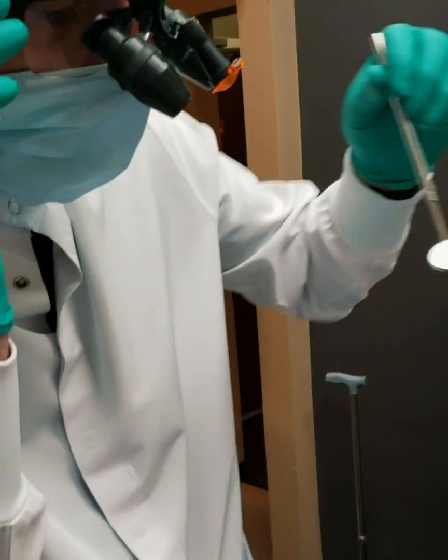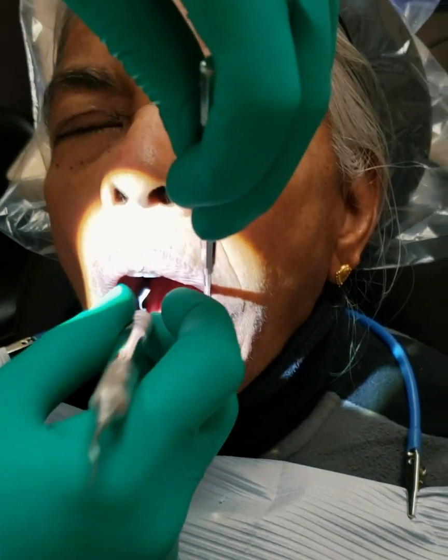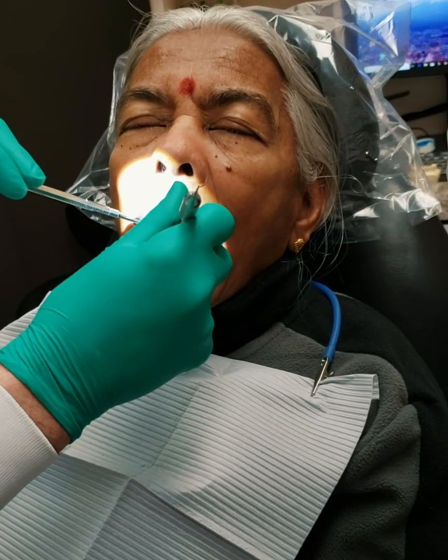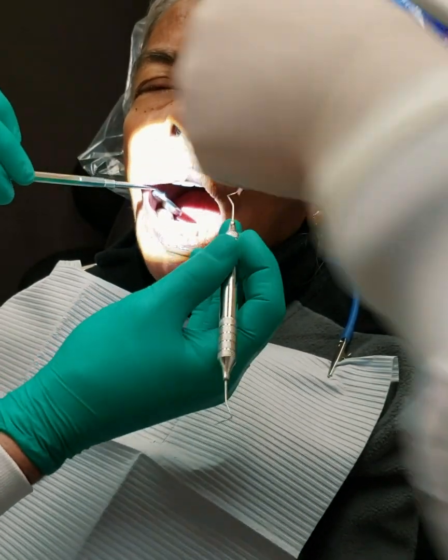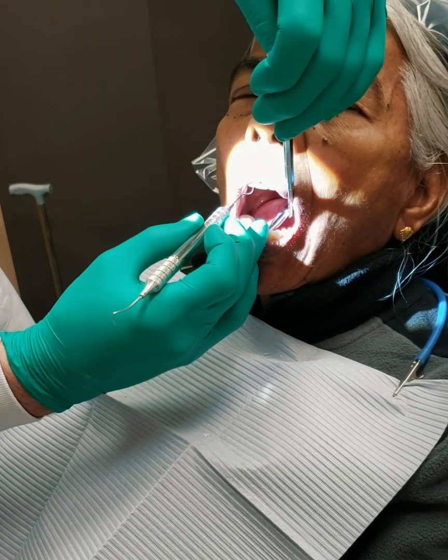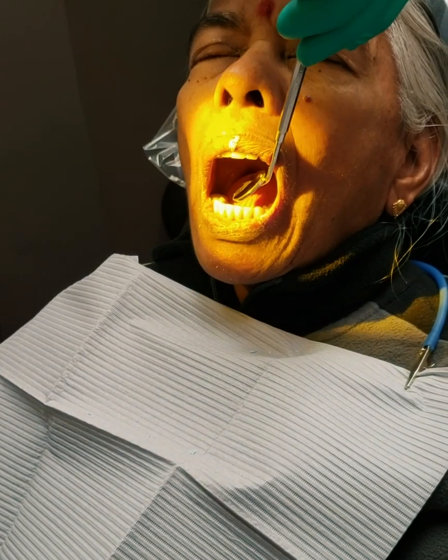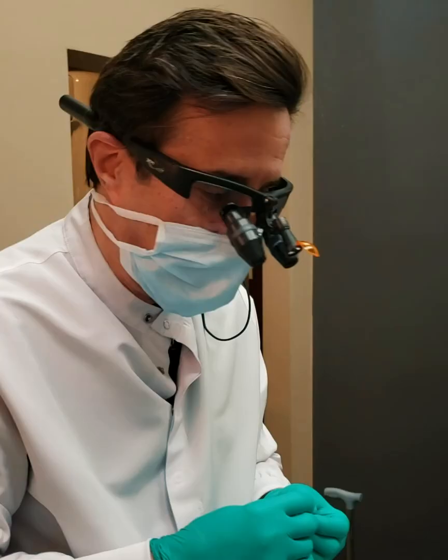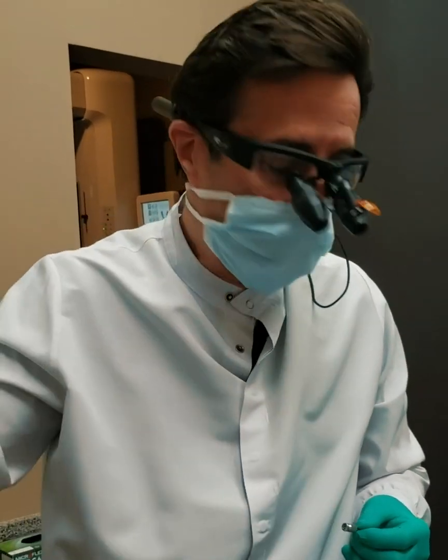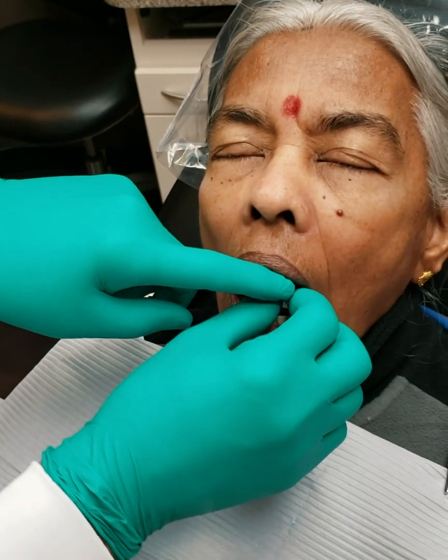Good. Okay. Now, the next thing we're going to do is to remove the GI mask that are in the holes. Once all of the coverings are taken off of the access holes, then what needs to be done is the temporaries need to be removed. I like to use a hand screwdriver.